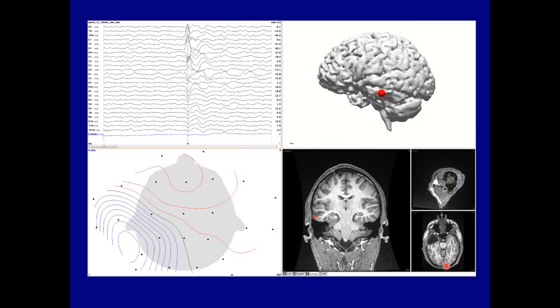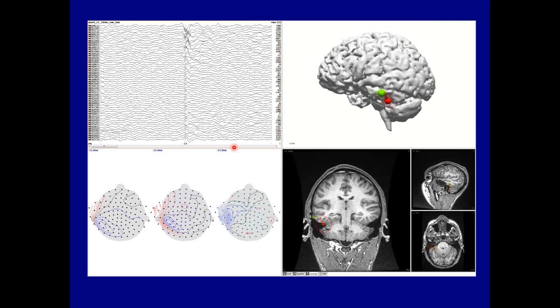Well, let's do a MEG in this guy. And here is the EEG, his remaining EEG spikes, in sort of an oblique type orientation. But EEG here was pretty good, saying, look, we have some residual source activity in this aspect of the temporal lobe posterior to his previous resection site, but he's got a hole in his head, maybe because of the surgery. Maybe we're being fooled by a breach rhythm here. We need some confirmatory information, so let's get the MEG.